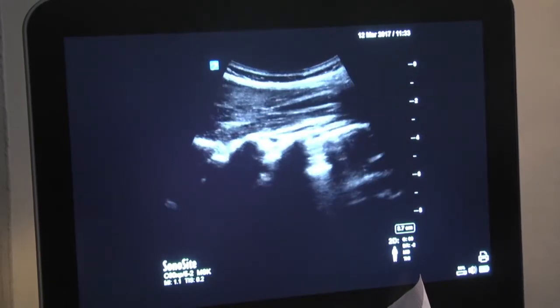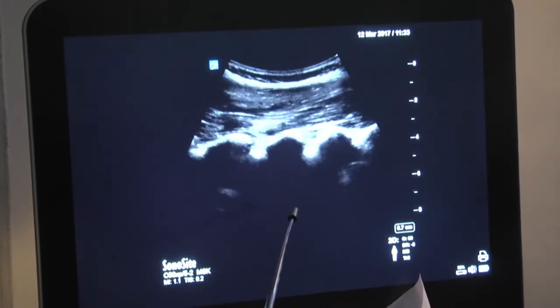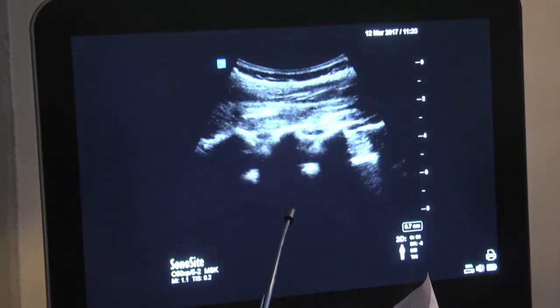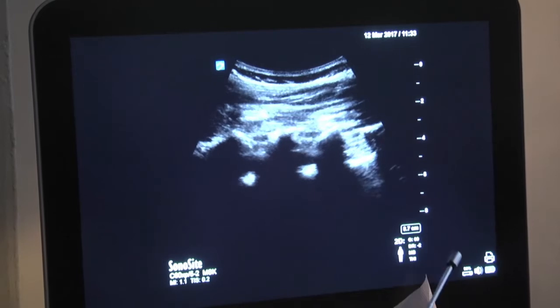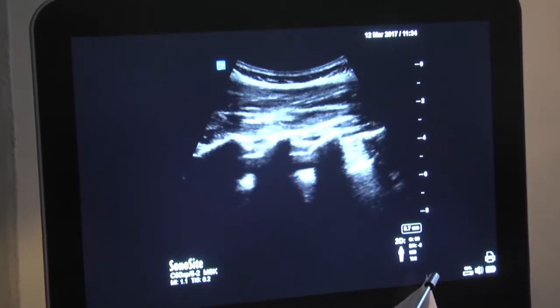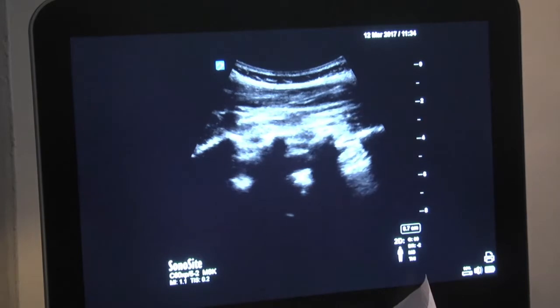So for neuraxial imaging, you want to see the lamina, and when you see 3, 4, 5, you will have to tilt the probe slightly medially. See, this is a true sagittal scan, okay? You can barely see the neuraxis, okay? You can see a little bit of a narrow thecal sac, but when I tilt it, well, look what happens. You tilt it, the dura becomes clearer. Can you see that? It becomes much clearer, the ligaments have become clearer, and all the structures are quite well defined.